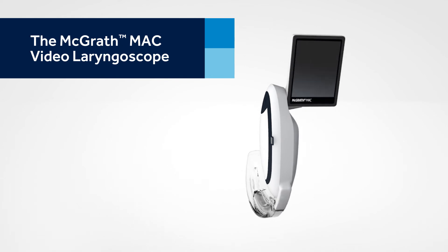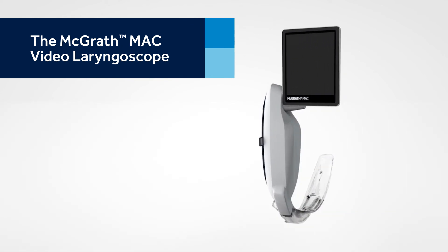With these basics in mind, you should be ready to put your McGrath MAC Video Laryngoscope into service.